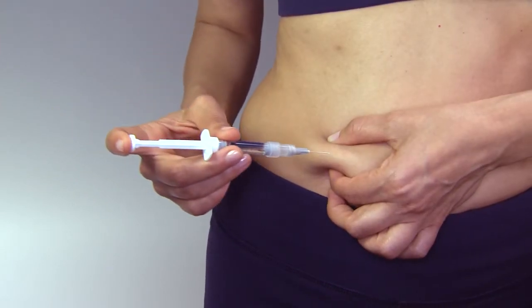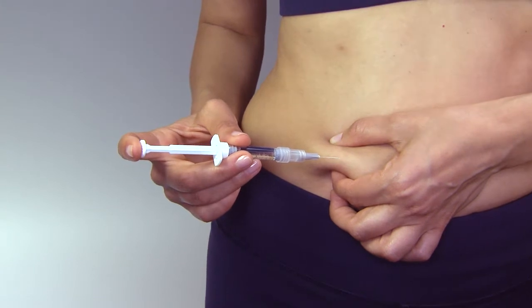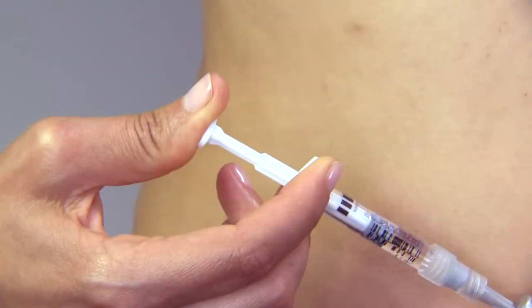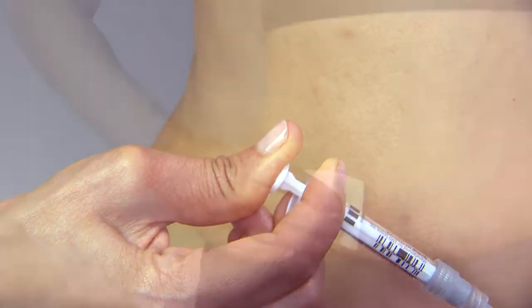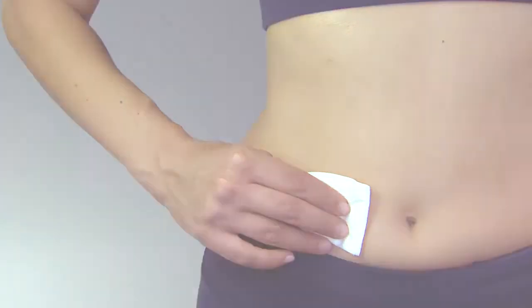Pinch the skin on the chosen injection site with the other hand. Insert the entire length of the needle into the skin at an upward angle of about 45 to 90 degrees, as indicated by your doctor or nurse. Release the hand pinching the skin and depress the plunger in a slow, steady motion until all the medication is injected. Gently withdraw the needle and apply pressure to the injection site by using a gauze pad.